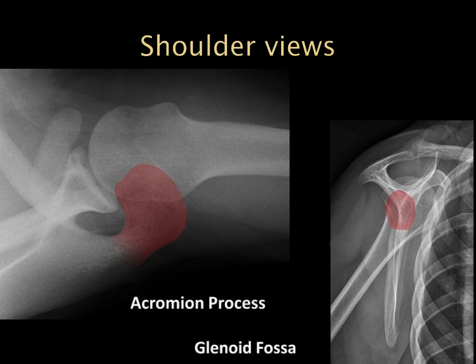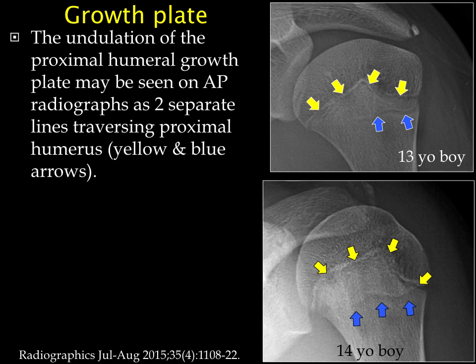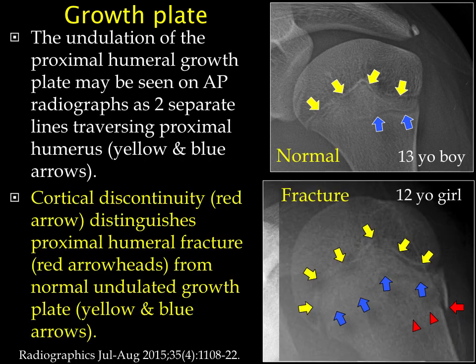Let's talk about some normal variants. We have our growth plate of the proximal humerus, and because this is a three-dimensional structure, the x-ray beam might actually intersect the growth plate in two positions. We do not want to mistake that for a proximal humeral fracture — the growth plate is normal. Separately, a fracture will show cortical discontinuity, and that is separate from the growth plate.